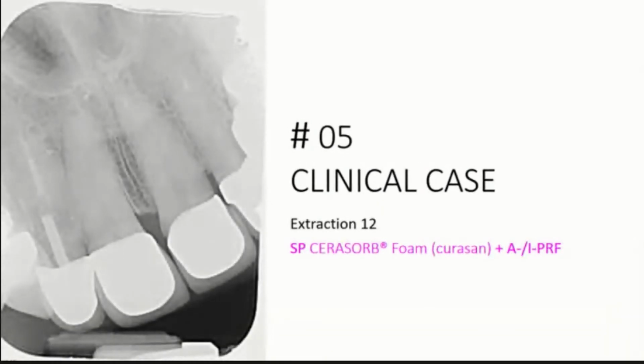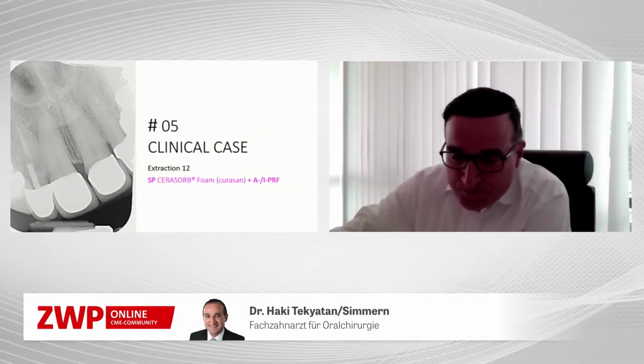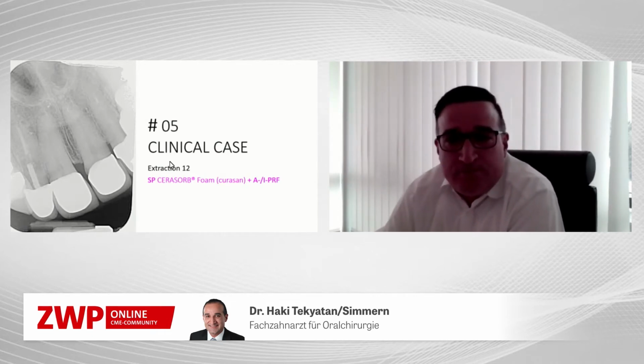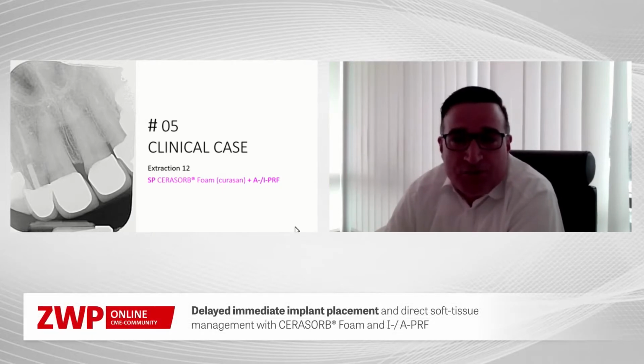So let's come to our second case. This is a case of an extraction of tooth 12 after fracture of a root canal treated tooth, socket preservation with CERASORB foam and activated with A-PRF.